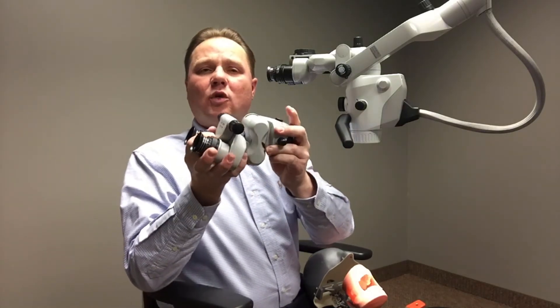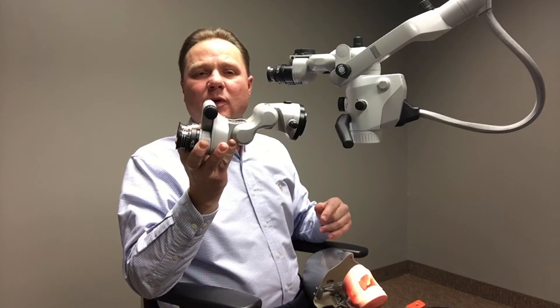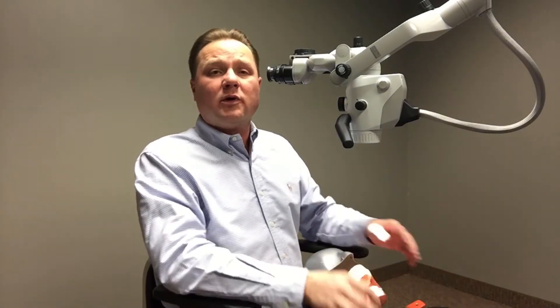Through this accordion motion, I can extend the binoculars out. And so it allows me to sit up to two and a half inches further away from the patient if the procedure or my physical stature would require that.